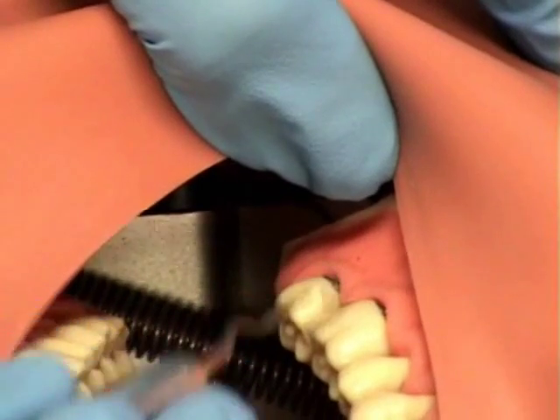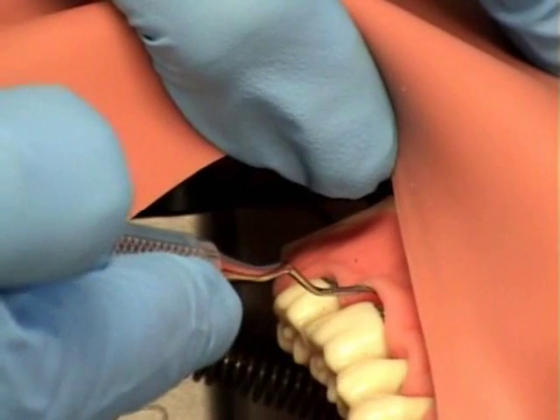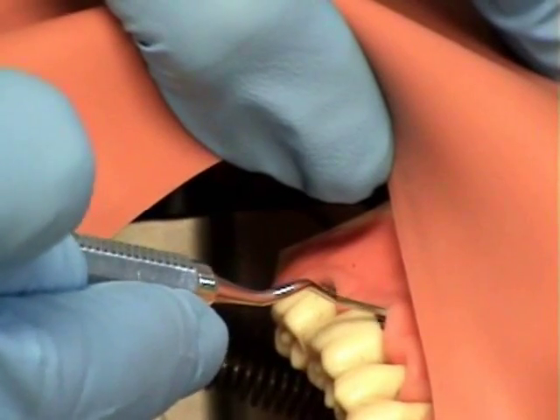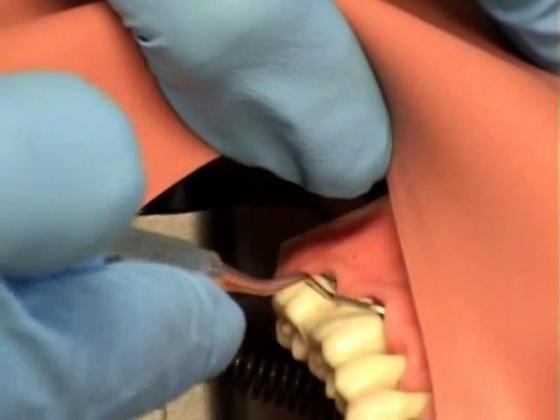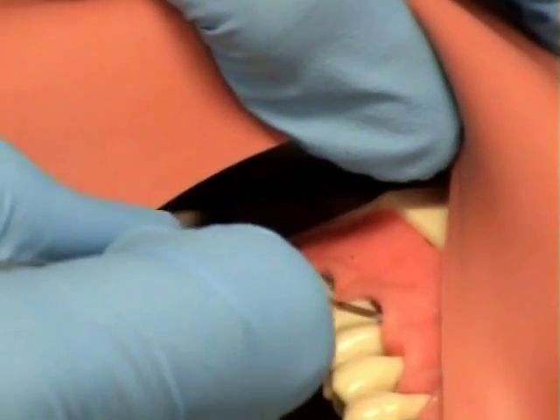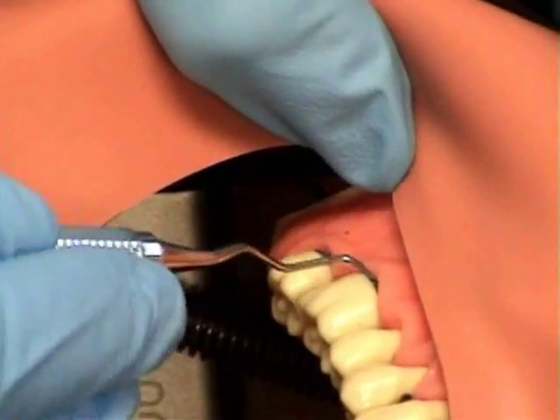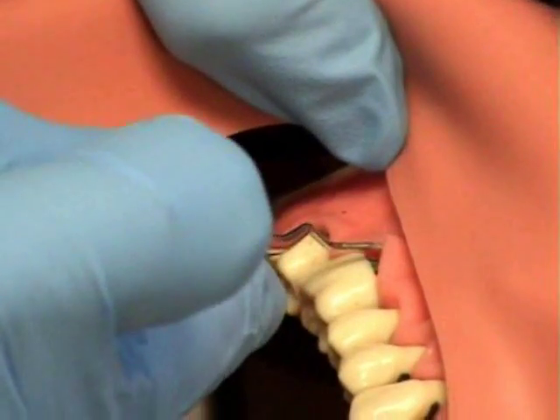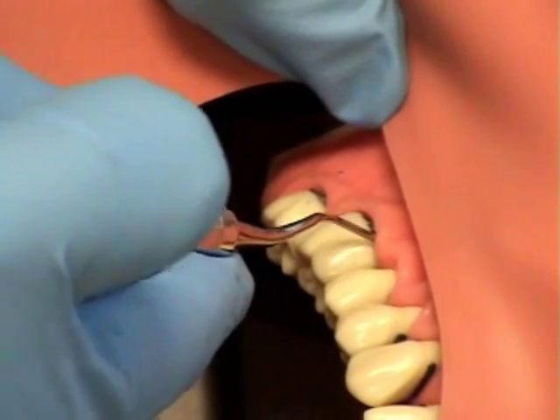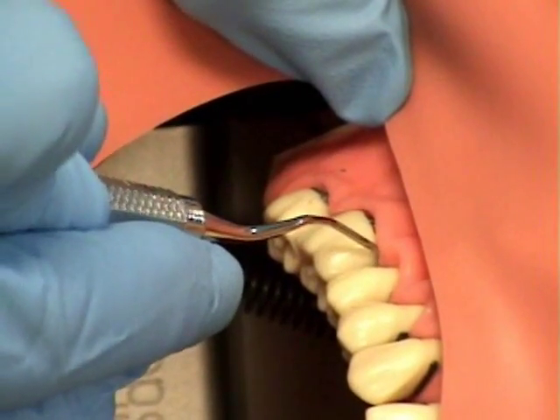Then she begins again at the distal buccal line angle of tooth number 19, and walks the instrument with an exploratory stroke until finding a deposit, where she opens the blade and uses the toe third to remove the deposit. As she gets to the mesial surface, you'll notice that the terminal shank is parallel to the long axis of the tooth.